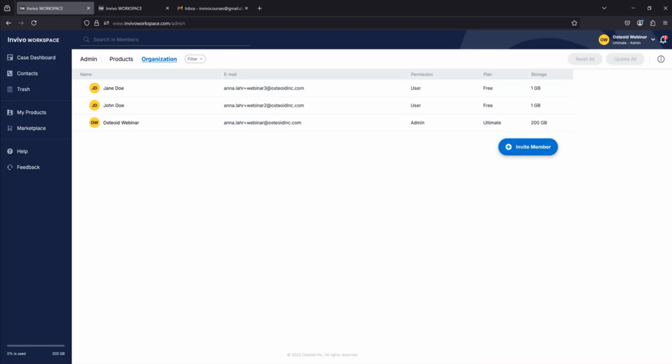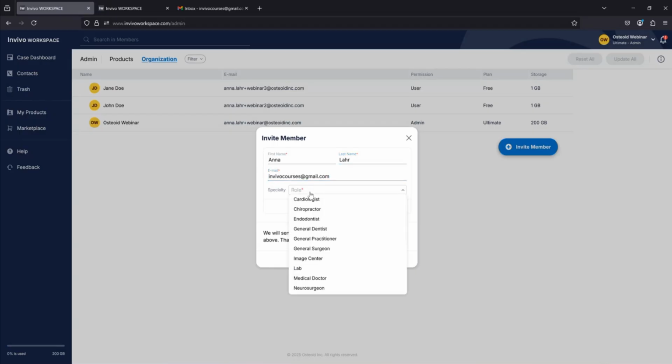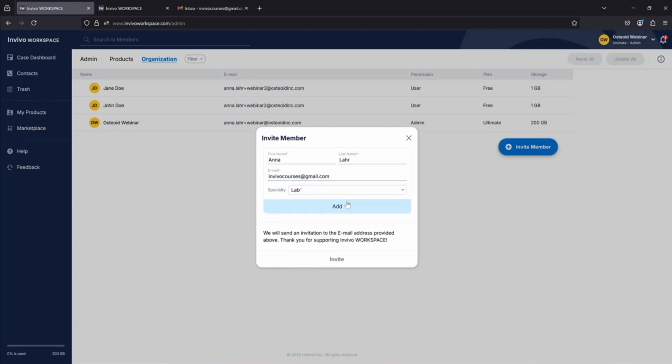So I'm going to invite one of my users here that I have in mind. We're in our admin organization page, and we can click invite member. We'll invite one of our courses emails. Again, selecting specialty, we'll just say it's lab.